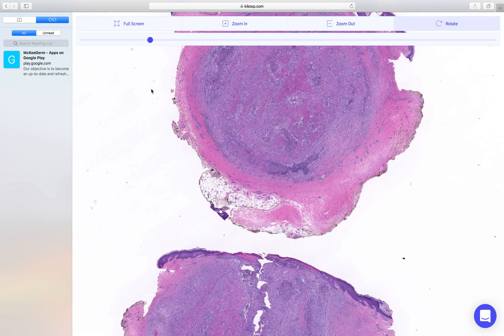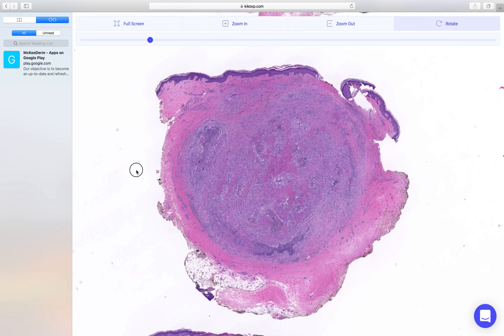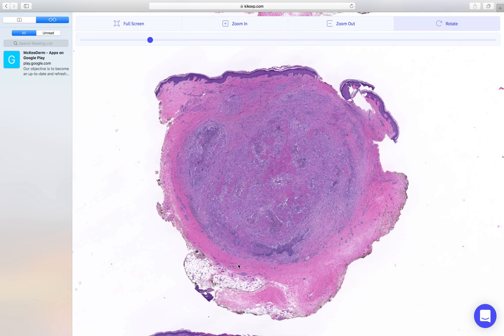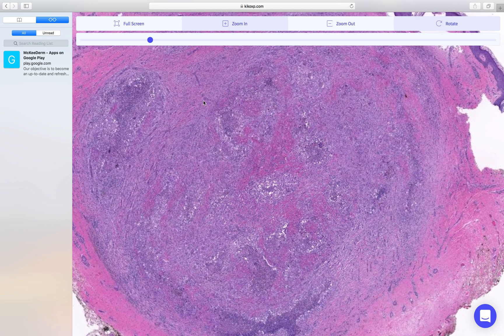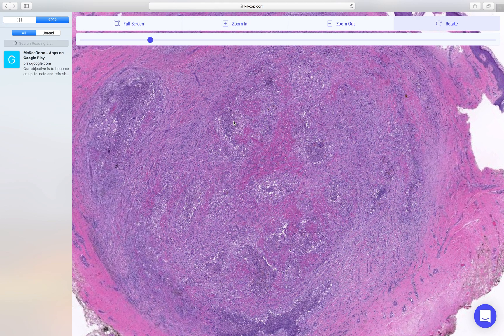Looking a bit closer, you can see the compressed pseudocapsule, an intense infiltrate, and even at this magnification you get an idea that there are abscesses. Looking closer still, we can see lovely neutrophil micro-abscesses dotted around, surrounded by granulomatous inflammation. This is the starting point for discovering why the patient has developed this reaction pattern.